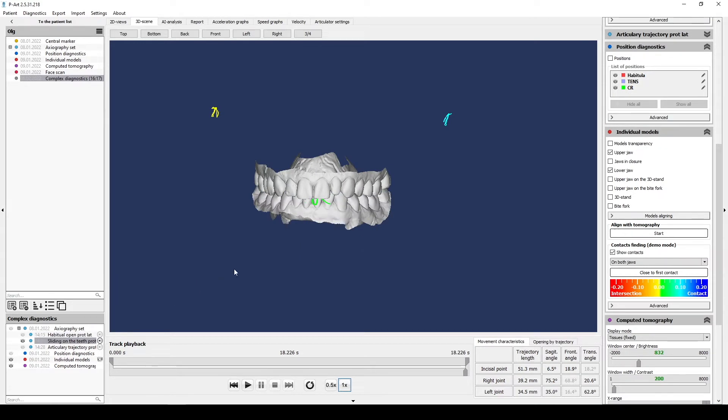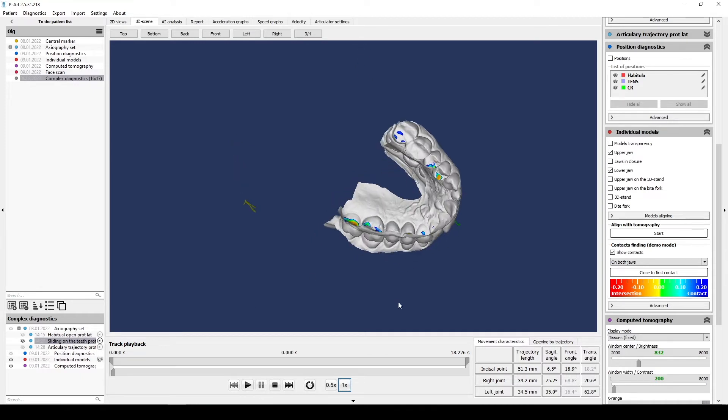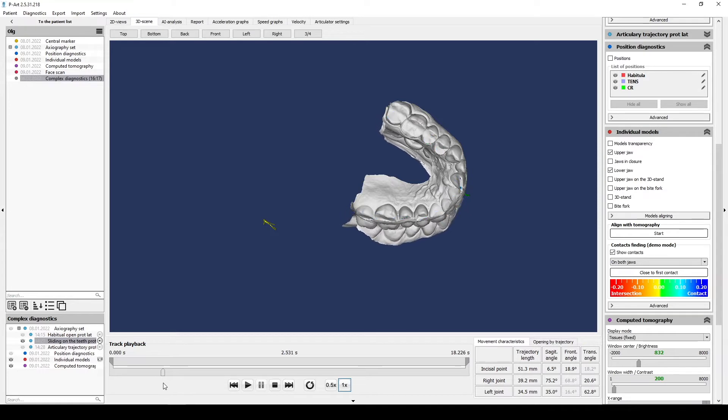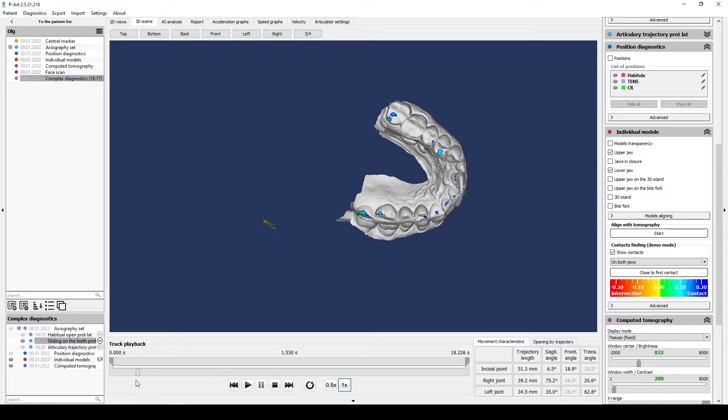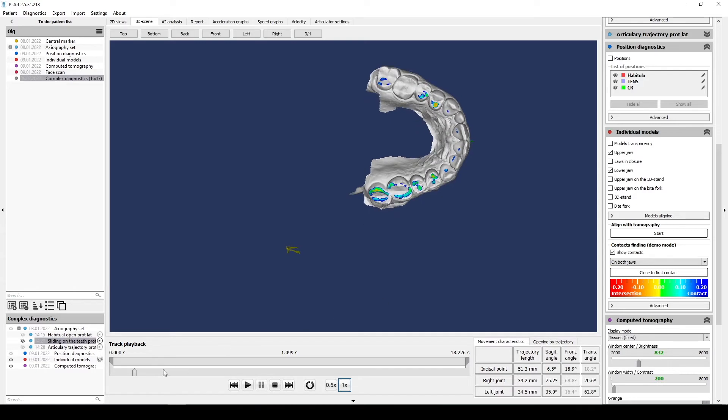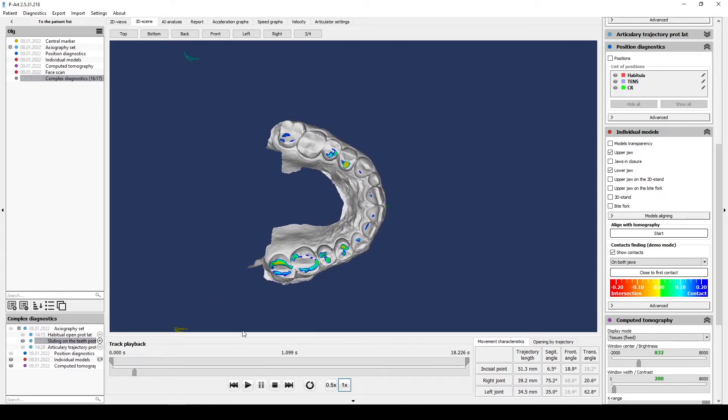The second axiography is movements with tooth guidance. Here you record protrusion and lateral trusion supported by teeth. It's necessary to analyze guidance teeth, presence of any super contacts in molar area, how lower jaw moves forward and returns back.